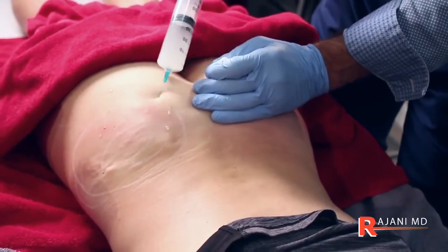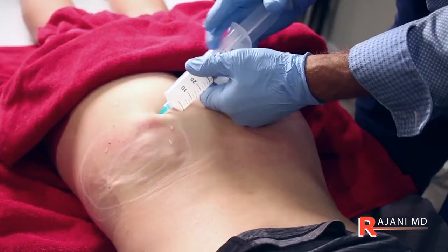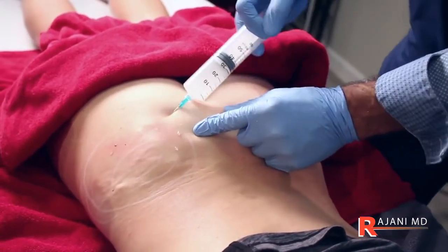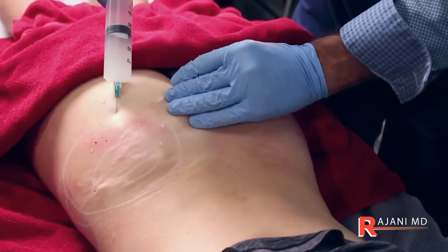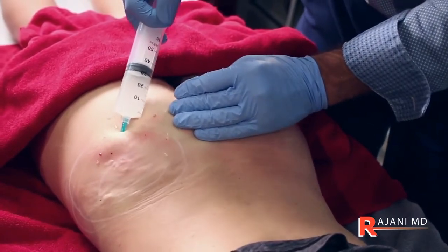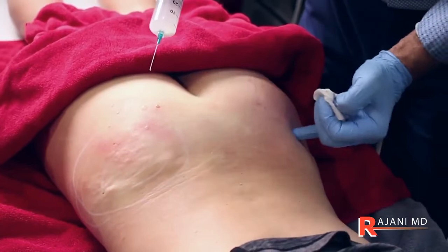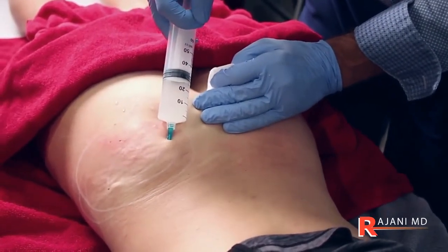So we have a question. Yes. Someone asked, is it better to use a larger syringe? You know, it's time. Time is money, and you can't buy time. You can use a 10 cc, which is the next one down that I know of, but it just takes so long to put in the amount of volume that we do. I make sure people do at least 5 syringes on each side, because that's really what's going to start the amount of volume.